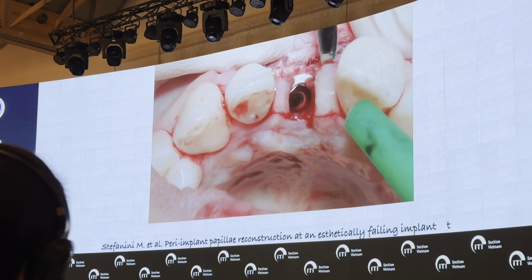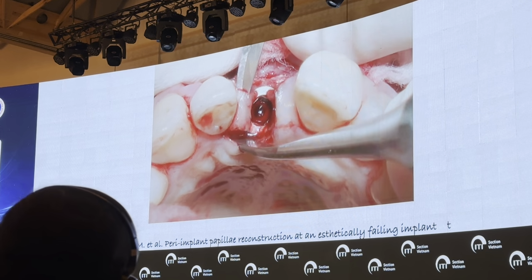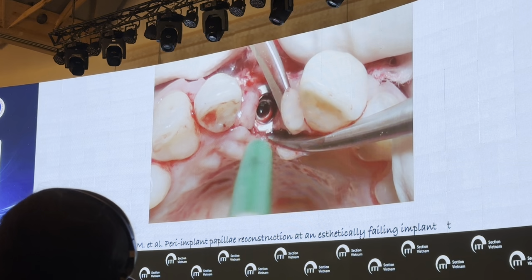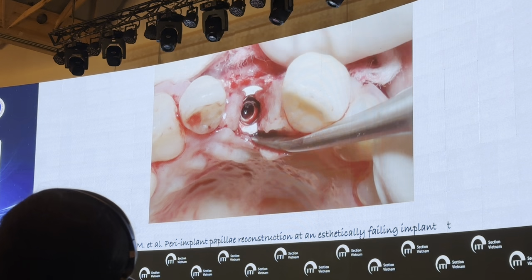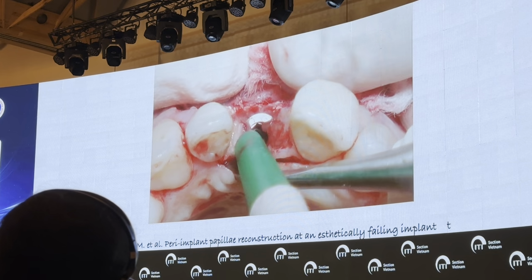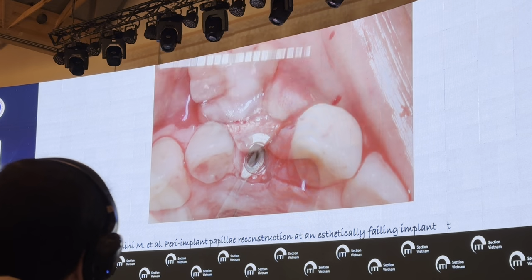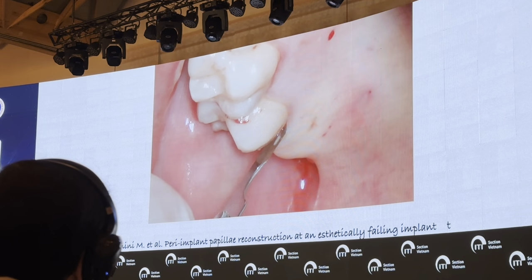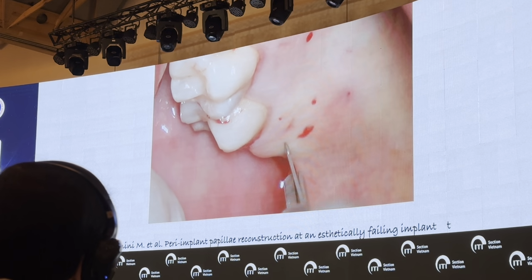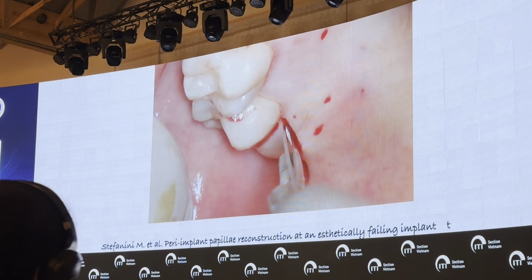Here we have the hole because of the implant in the middle, but we will have enough connective tissue mesial and distal with respect to the implant to facilitate the graft fixation above the platform. So we are basically going to completely submerge the implant, placing the connective tissue graft on top to allow the interproximal soft tissue improvement.